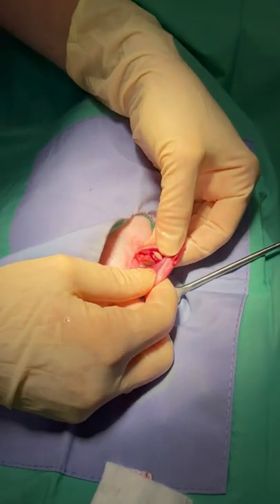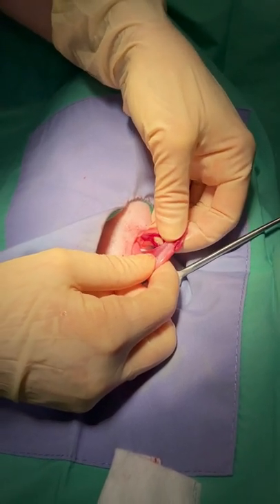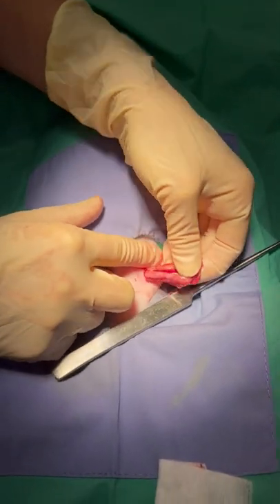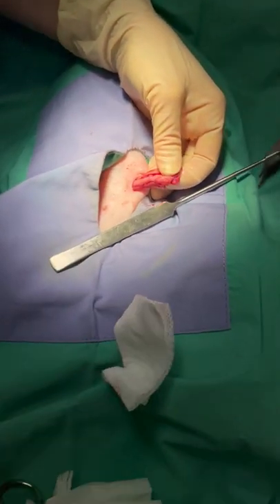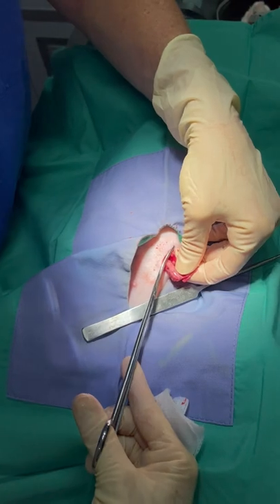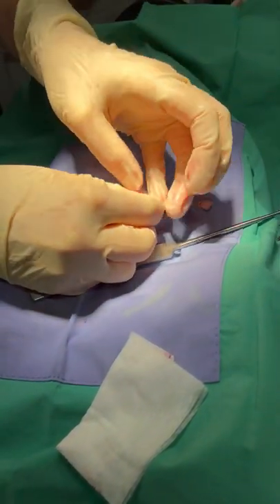This is the most painful part of the procedure because pulling on the suspensory ligament is very painful. If we don't have a good plane of anesthesia, now is a good way to find out — we've double-checked our plane of anesthesia for her. If this is too tight and you cannot maneuver, there's no reason to be a hero. Let's make our incision a little bit bigger, very carefully, so that we're not pulling too hard. There's no reason to take a risk just to have a small incision.